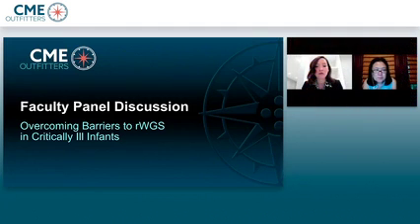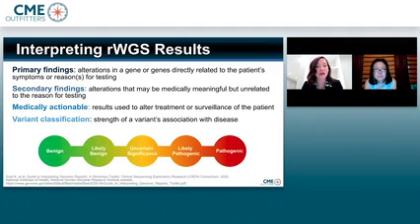Absolutely. Great. Let's go ahead now and discuss a little bit about interpretation of results from rapid whole genome sequencing.